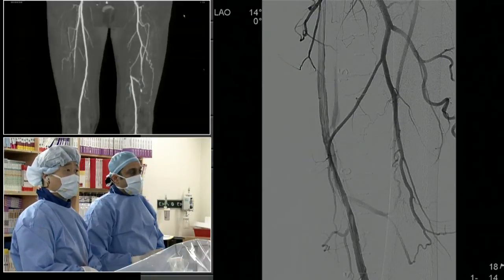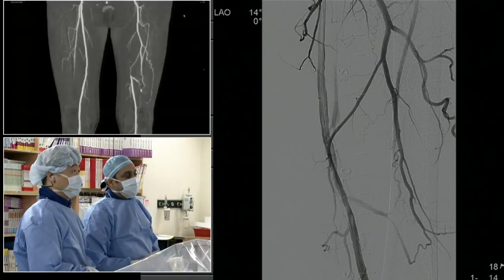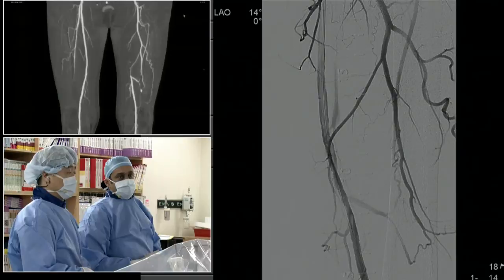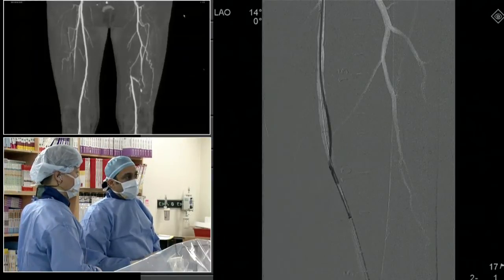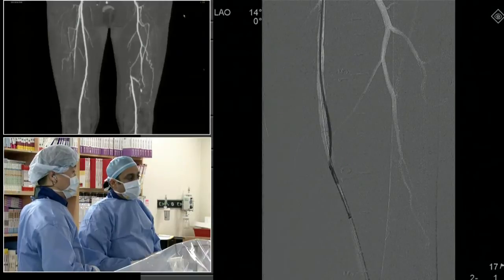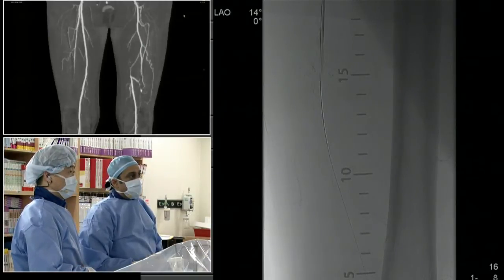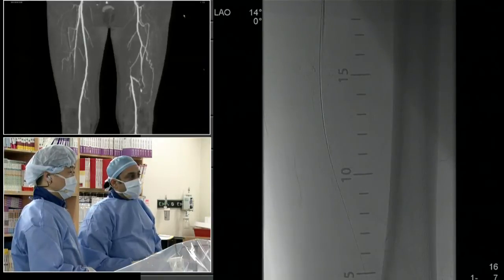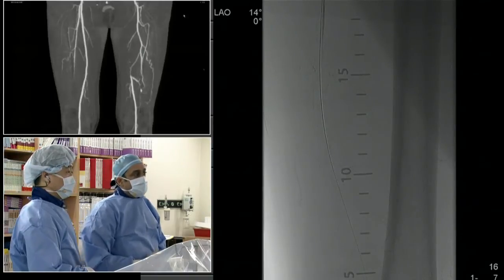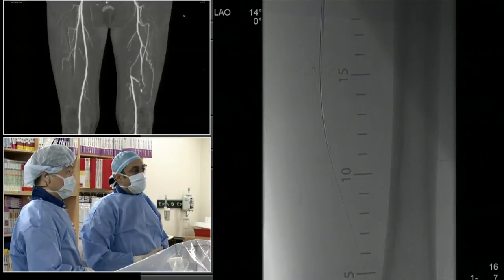What does everybody think? Would you do the drug-eluting balloon? Would you place a stent, a covered stent? Any ideas? As I mentioned, this is a very good diameter. Yeah. I like that. You know, in the U.S., we don't have commercial availability of drug-coated balloons. So at this point, again, particularly since it's a long CTO, we would end up having to bail out to long balloon inflation for a period of time. But understanding that the restenosis rate was relatively high, we would probably stent.